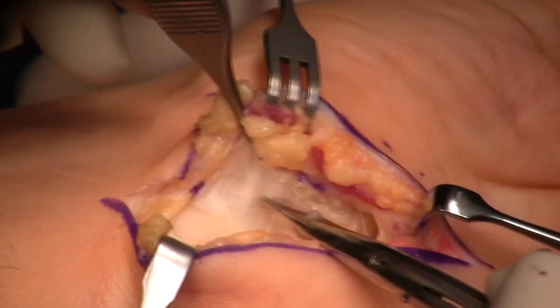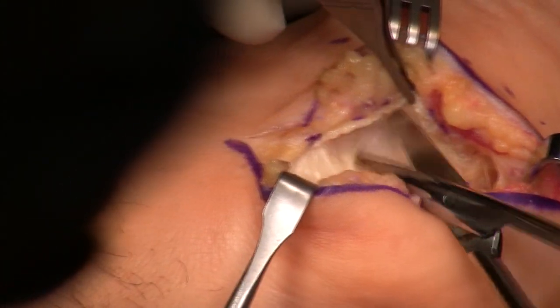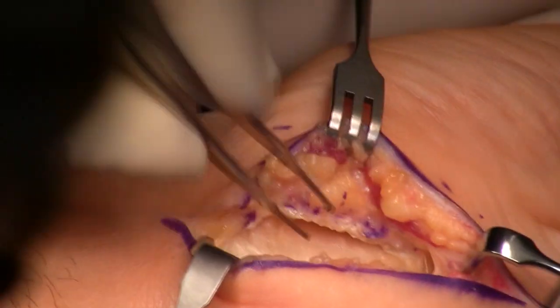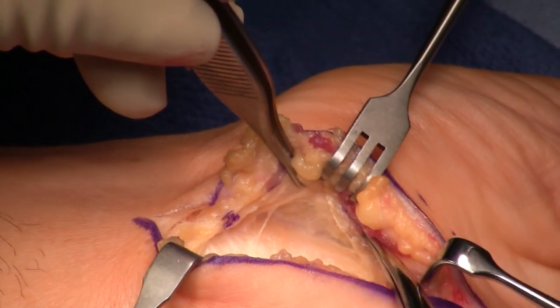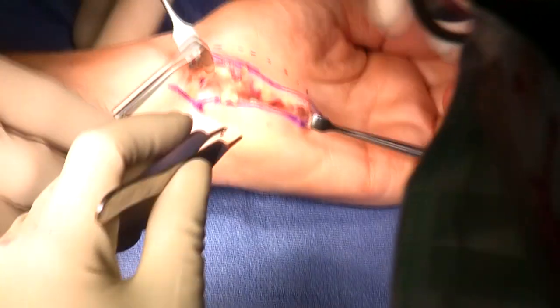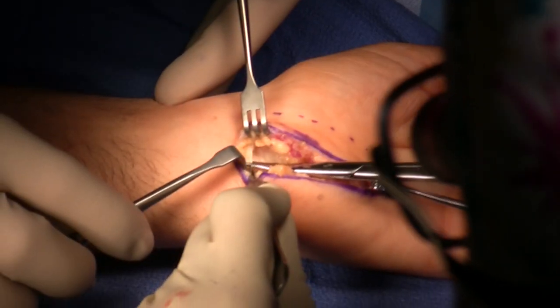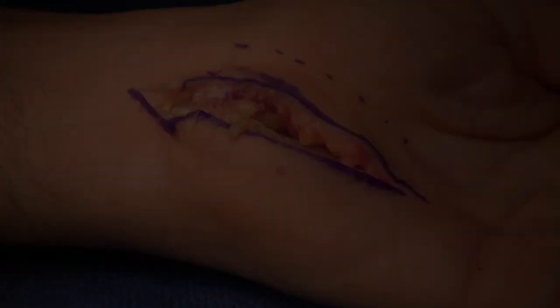This is really interesting to see here. Look at this connective tissue between the overlying flexor retinaculum and the median nerve. I think this is what Peter Amadio talks about as an etiology for carpal tunnel — that thickening of the synovium above the median nerve. There's the flexor retinaculum, and it will heal away from the median nerve which is tucked well under the flexor retinaculum. Now I'm going to go to the end of the table to absolutely visualize the anti-brachial fascia so there are no injuries, no poking around the median nerve.